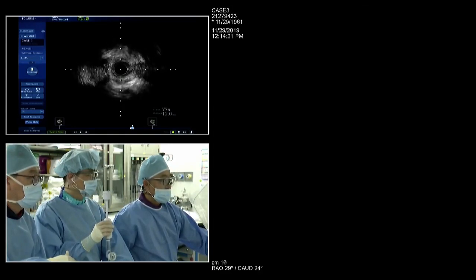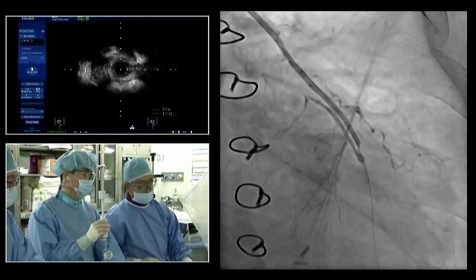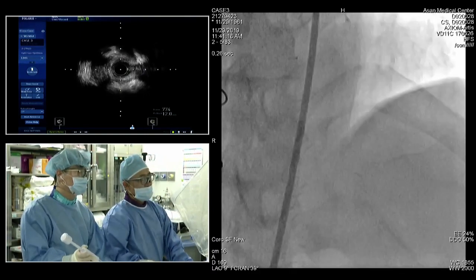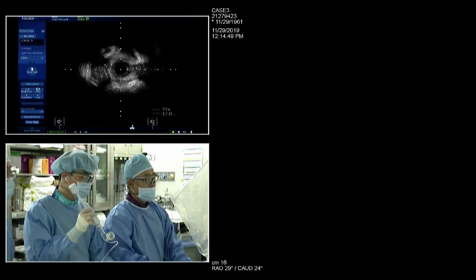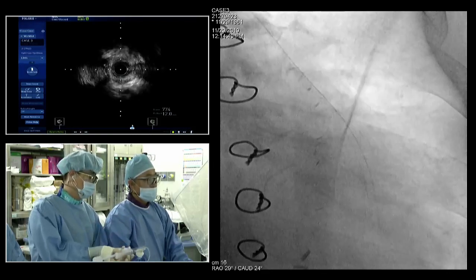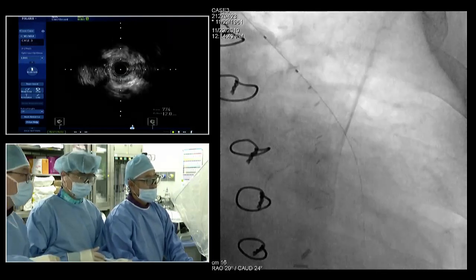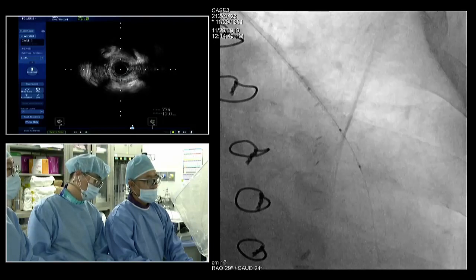In my experience, this type of early restenosis of LIMA to LAD is easily managed by plain balloon angioplasty. In my experience, this type of lesion has no restenosis after balloon dilatation. I remember even in the old times when we did not have stents, these were the lesions that responded best. But what about doing a drug eluting balloon after the angioplasty? Maybe optional, an option. But let's see the result after the dilatation.